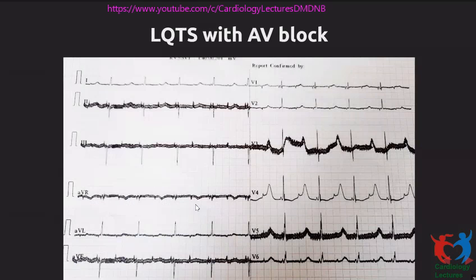This was an ECG shared with me by a pediatric cardiologist just about a month back, of a child that he had seen. You can see here, it's a noisy ECG, but if you look at V4, you can see very clearly there is bradycardia for a newborn. You can see a P wave here, which is conducted, and a P wave here, which is not conducted. There is 2:1 block. Look at the QT interval. The QT uncorrected here is about 800 milliseconds. Very clearly you can see the P wave is here. You obviously cannot get a QRS here, right? Because the T wave is there. So this is a functional 2:1 block because of a very prolonged QT interval. My advice on what was done in this patient was to put an epicardial pacemaker, and treat the child with beta blockers.